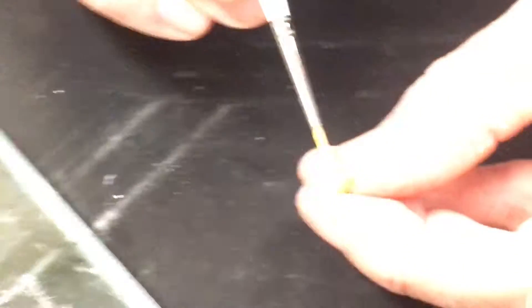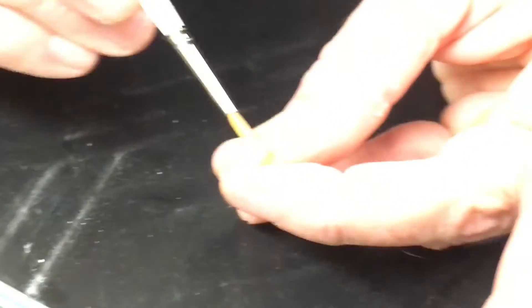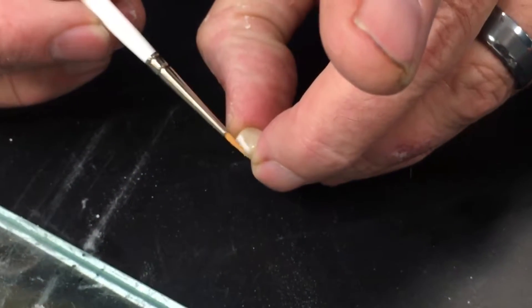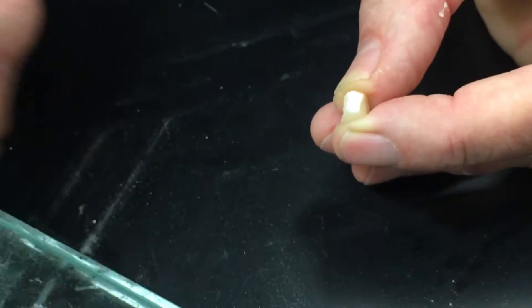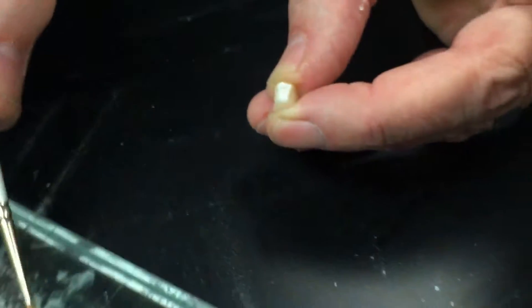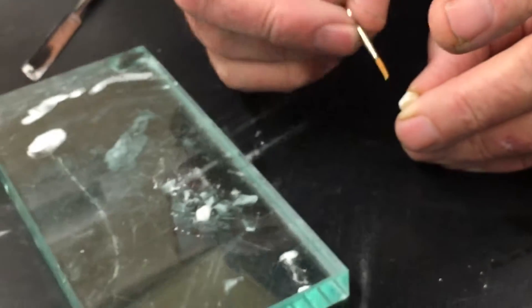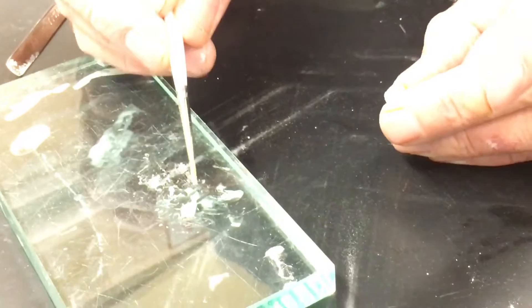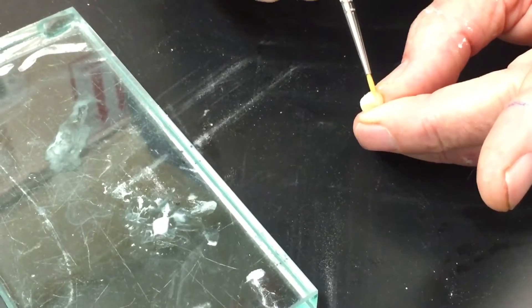Working with porcelain, the big deal is moisture control — just kind of the experience of how wet or how dry it needs to be. I don't want this to really super dry out either, so occasionally I'm just going to take a little bit of my liquid and add some. With the CAD/CAM you have to use this add-on liquid specifically. All the other porcelains I use, I can use water, but this I have to use an add-on liquid — otherwise it has a tendency to crack.